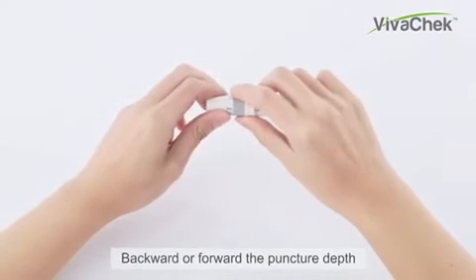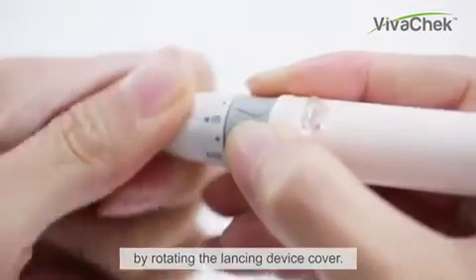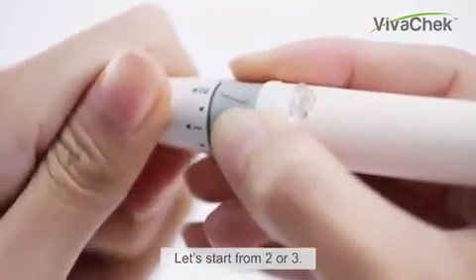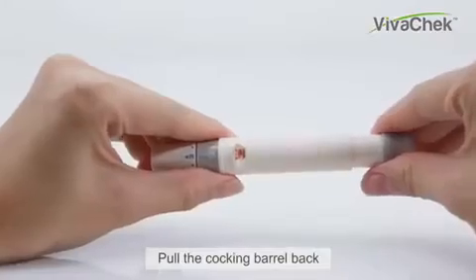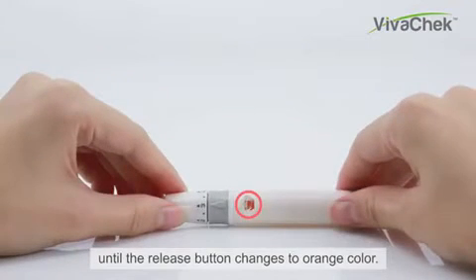Adjust the puncture depth by rotating the lancing device cover forward or backward. Start from depth 2 or 3. Hold the cocking barrel back until the release button changes to orange color.